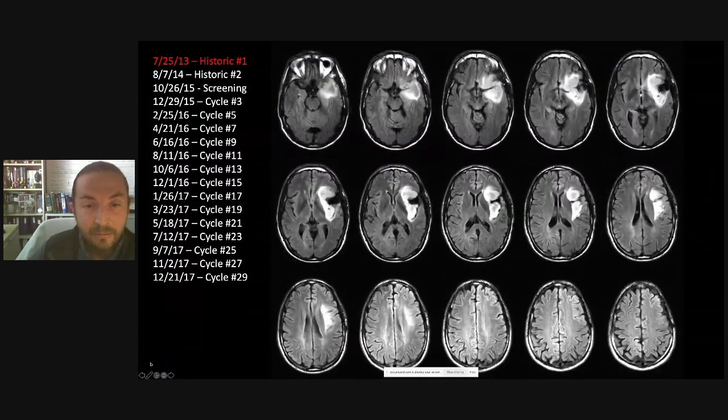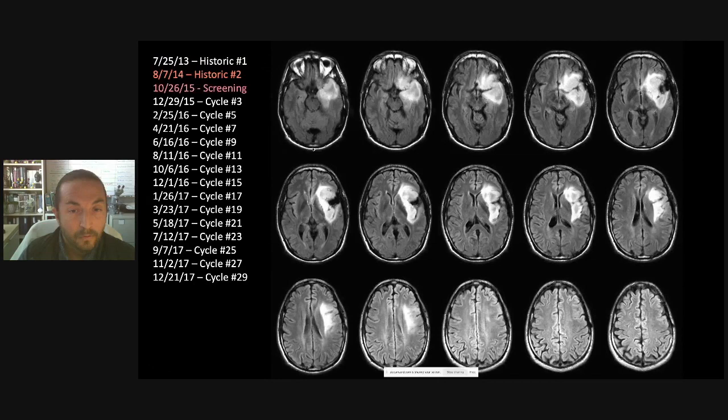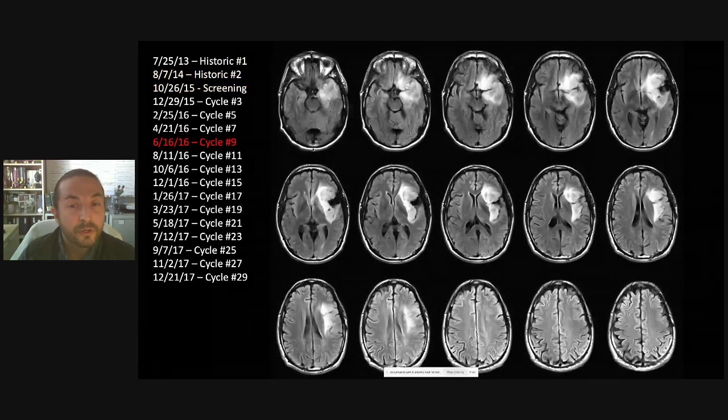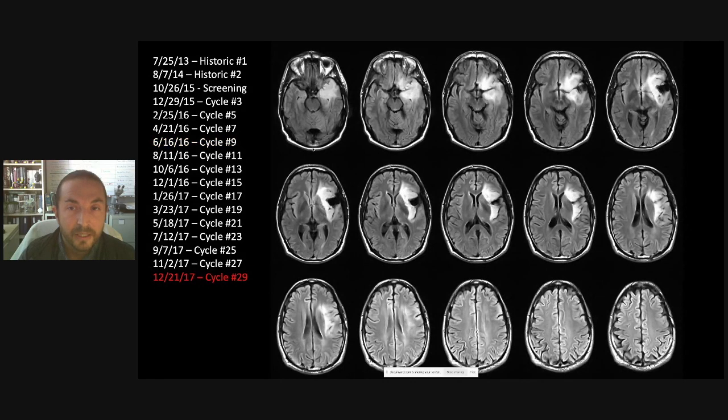I'll give you a quick example of this. These are images that we've, again, aligned and resampled, and then we look at them over time to see if the tumor is growing or shrinking. In this first set of slides, you're going to see the tumor growing over time in these same images. And then you can see an effective treatment response where the tumor is actually shrinking over time.